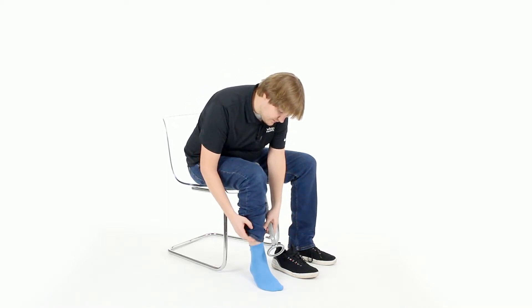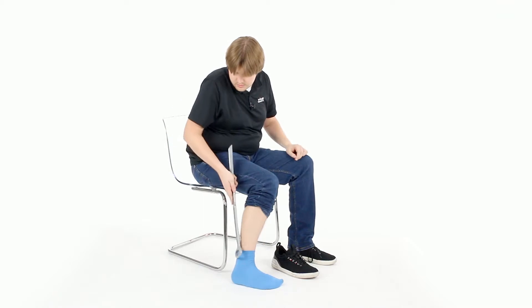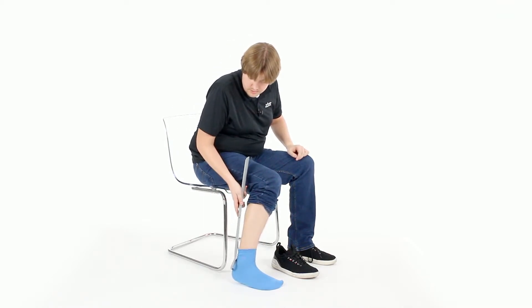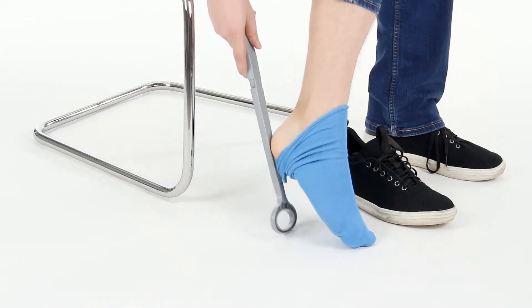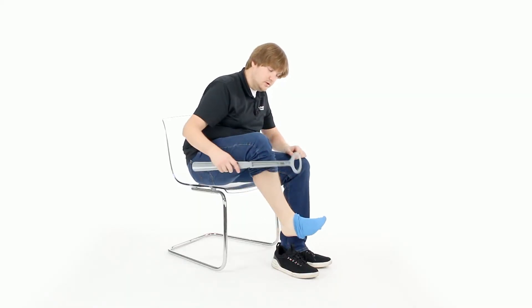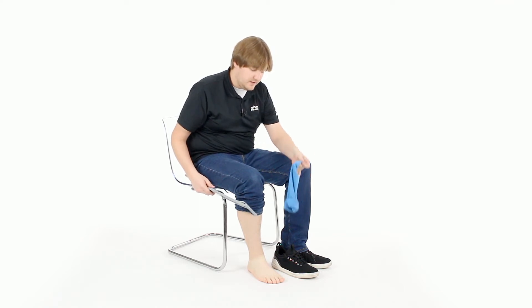To use a sock remover, it's very simple. You'll get the hook, hook down generally at the back, above the heel of your sock, and push down, lift your foot up, get it past your heel, and then from there the sock can be removed very easily.